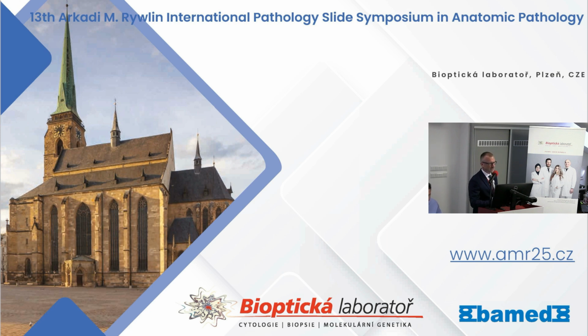It's better with ductal carcinoma, which it recognizes, but the rare variants, it depends on how it is trained. You can get acinar carcinoma everywhere. Thousands and thousands, millions of slides, no problem with training.